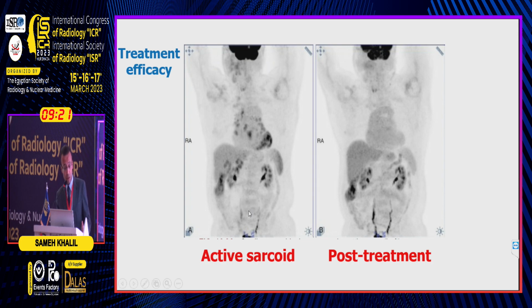Also, we can monitor the treatment effect, as in this patient with active sarcoidosis in the mediastinum and cervical region, we have complete resolution in the post-treatment study.